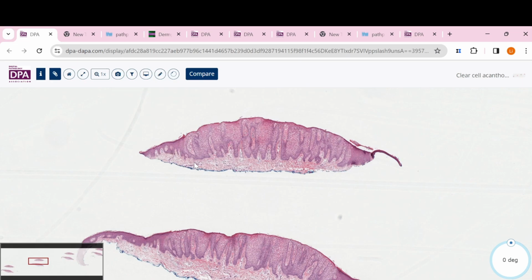So you may think about psoriasis, but something you do not have is the parakeratosis with the neutrophils. But I would like to tell you this lesion, you also can find neutrophils in the top and even in the epidermis. But one thing can take you apart from the psoriasis diagnosis and make this clear cell acanthoma diagnosis is in low power.